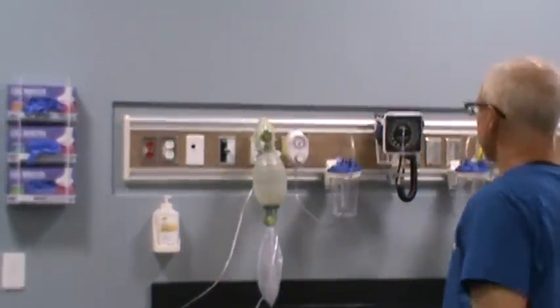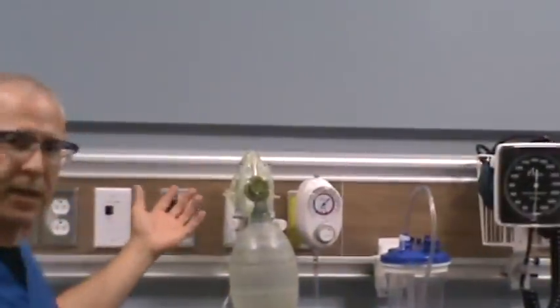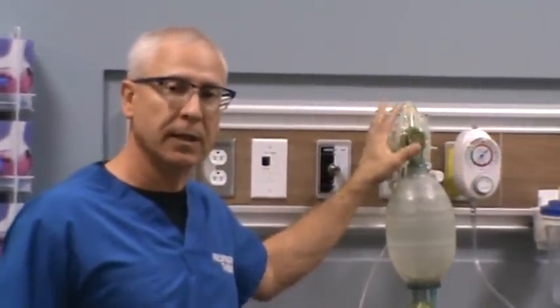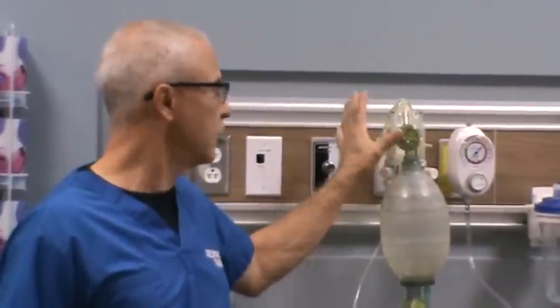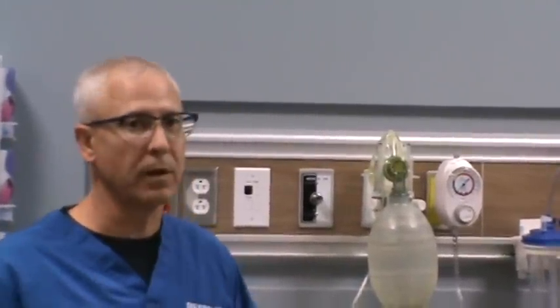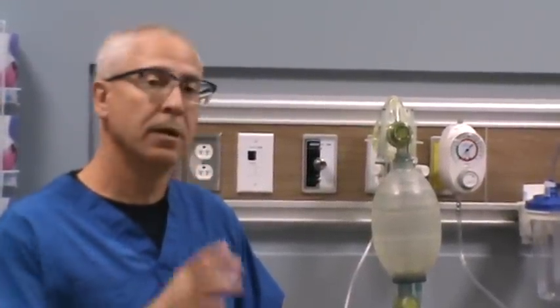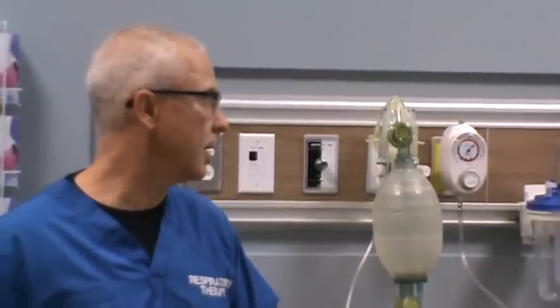In hospitals, it might look something like this — we've got our manual resuscitator, or bagger as it's commonly called, hanging on the flow meters attached to the station outlet. They should be attached to the oxygen station outlet with oxygen flow meters. If you're working anywhere within the hospital, you should have your bagger attached to the flow meter hooked up to 100% oxygen.